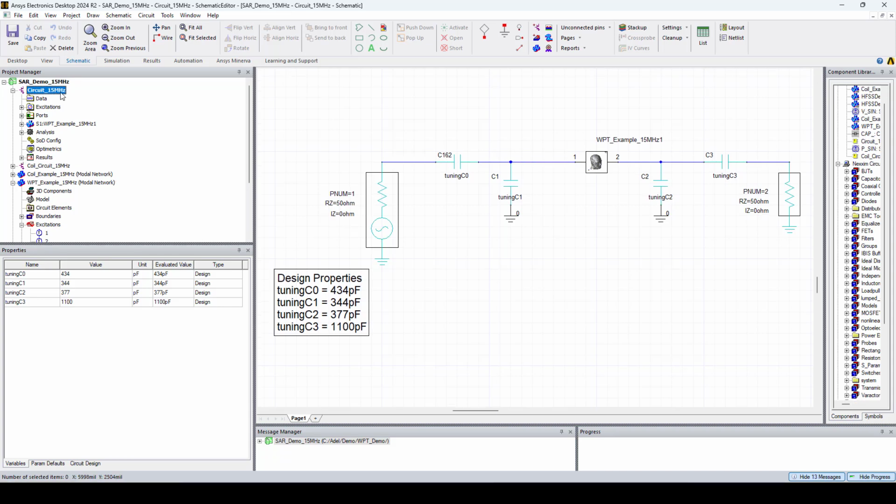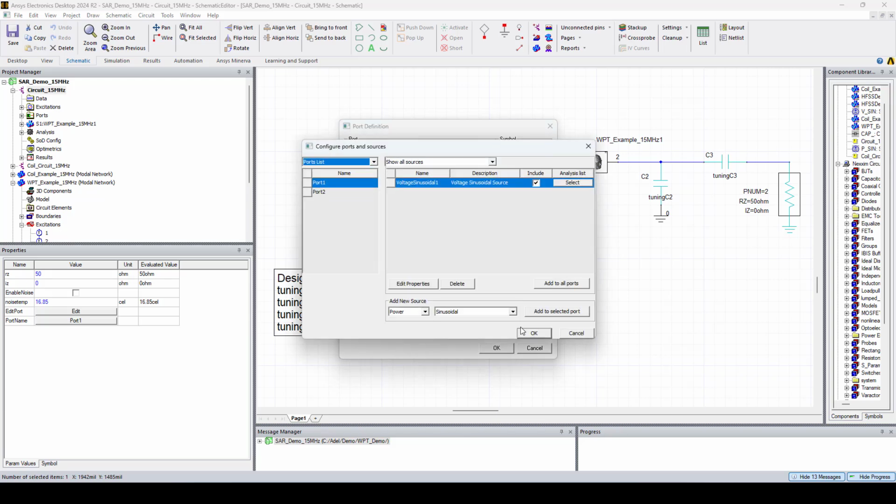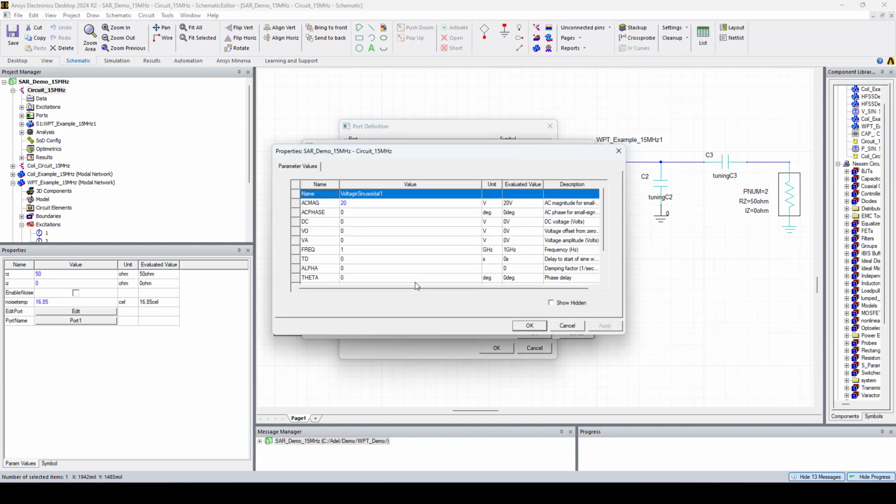Co-simulation allows the circuit model to control excitations for post-processing of the EM solution. To set 1 watt of input power in HFSS with a 50 ohm load, we need to set the AC mag in the voltage source properties of port 1 to 20 volts. This is based on the relationship VA equals square root of 8 times Pmax times R. So if I double click on port 1 and go to edit sources, edit properties, you can see that AC mag is set to 20 volts.